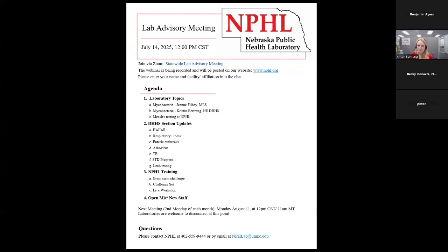So if you are seeing a pyrazinamide lab result coming back, you probably won't see it on drug susceptibility testing, but we will get you a whole genome sequencing report to help identify any mutations, especially in that PNCA gene, which shows the likelihood of being susceptible to pyrazinamide. And if you are using a private lab such as ARUP, we still can go ahead and do the whole genome sequencing or work with our lab to make sure that can be done, as that is a clinician decision how that will be handled.